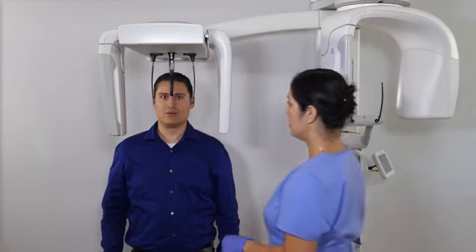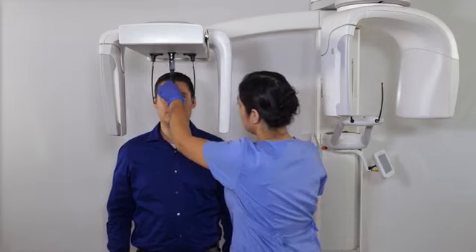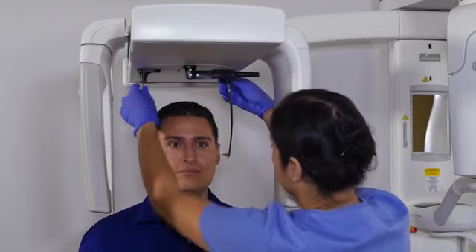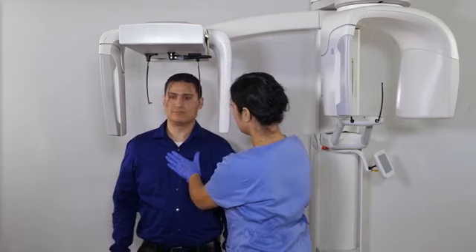Release the patient from the cephalometric by rotating the nasion marker up and pushing out the otic posts. Help the patient exit the Vantage system.